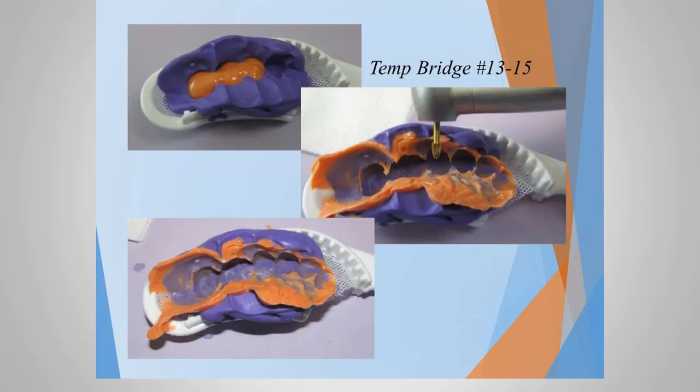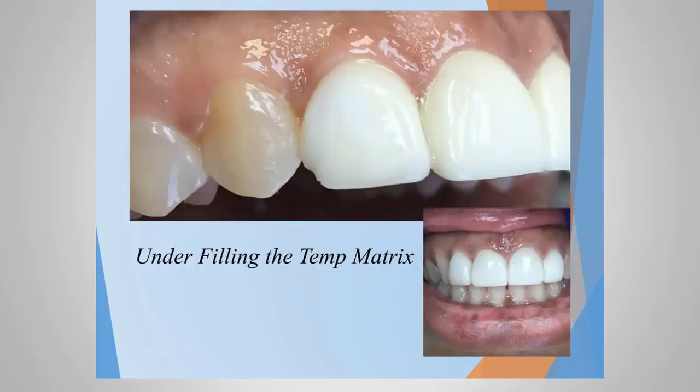So again, that's when this two-step technique comes into place, where you're just putting, again, light body material inside the impression, letting it set up, and because these areas are kind of ragged, not defined, I'll go back in with my finishing burr to make them more defined and more crisp, so that when we make the temporary, it's nice and clear, and again, less time on contouring and adjusting because of the steps that we've taken to make the impression nice and defined.